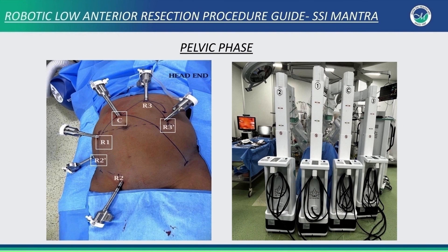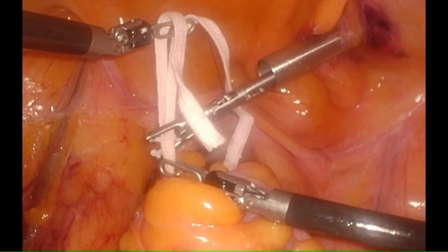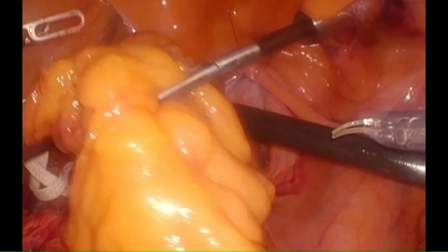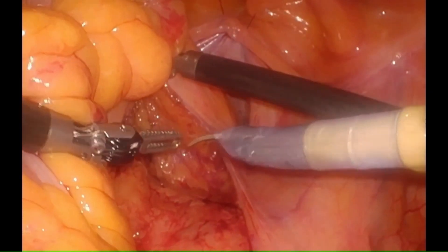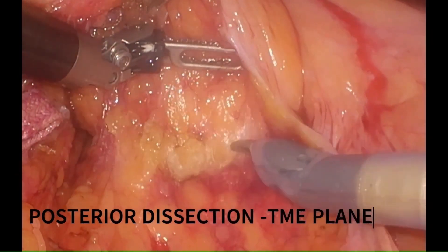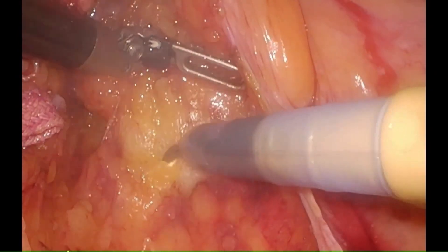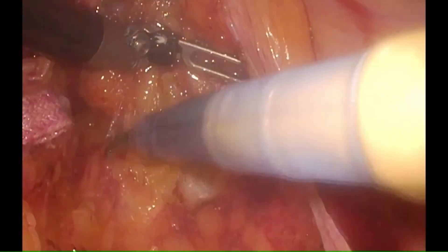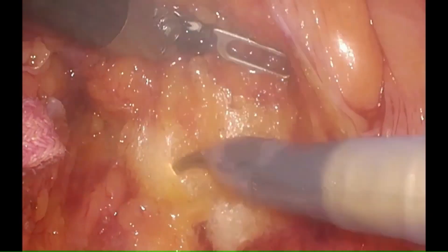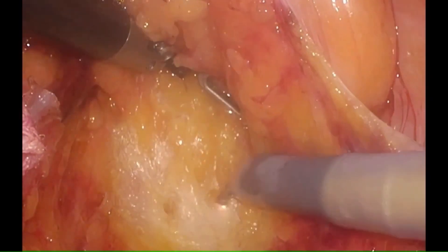After completion of the abdominal phase of the surgery, we start the pelvic phase. After hitching the bladder to the anterior abdominal wall, we pass an umbilical tape under the rectum, which is held by the assistant for retraction. After getting adequate retraction, we start the total mesorectal excision posteriorly first. Proper identification and preservation of the hypogastric nerve is done with a thin layer of presacral fascia over it.